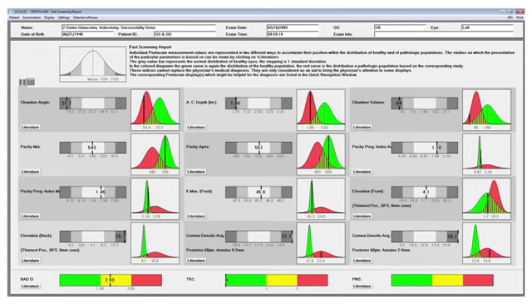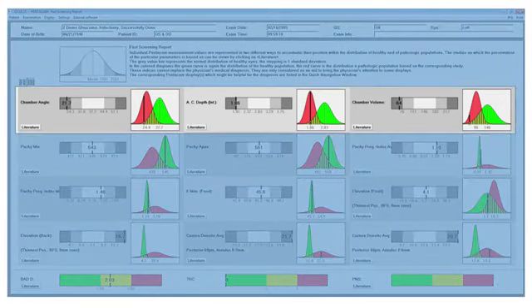And this can be helpful for quickly assessing to see if there are any abnormalities that could potentially be pathological. This is good for detecting occludable angles. It's good for detecting early ectasia. It's also good for detecting corneal opacity such as corneal edema or scarring. This is an example of a patient with occludable angles, and as you can see, their chamber angle, chamber depth, and chamber volume are clearly in the red.